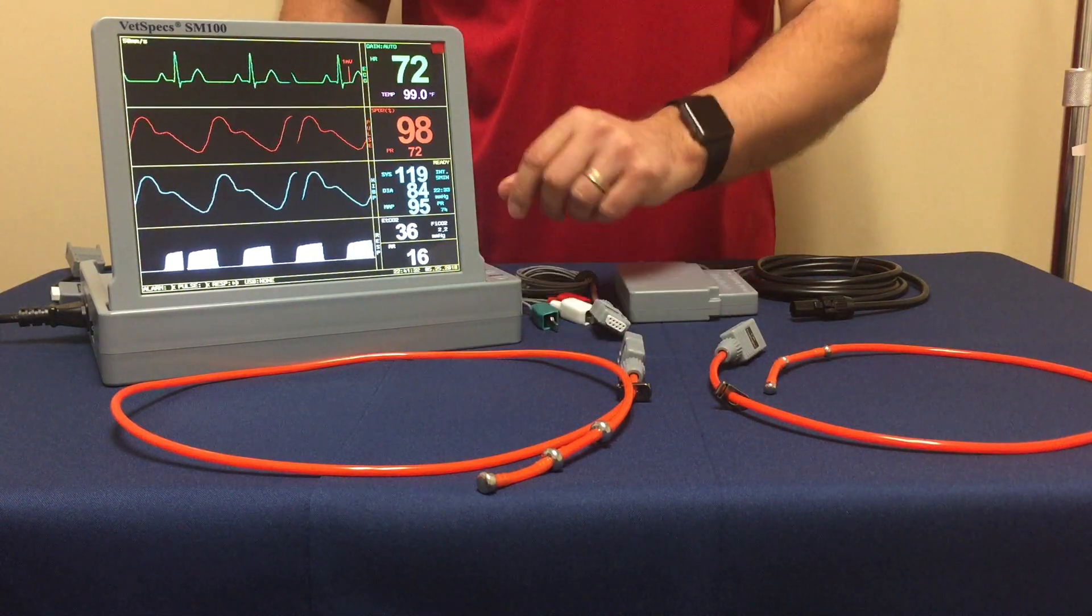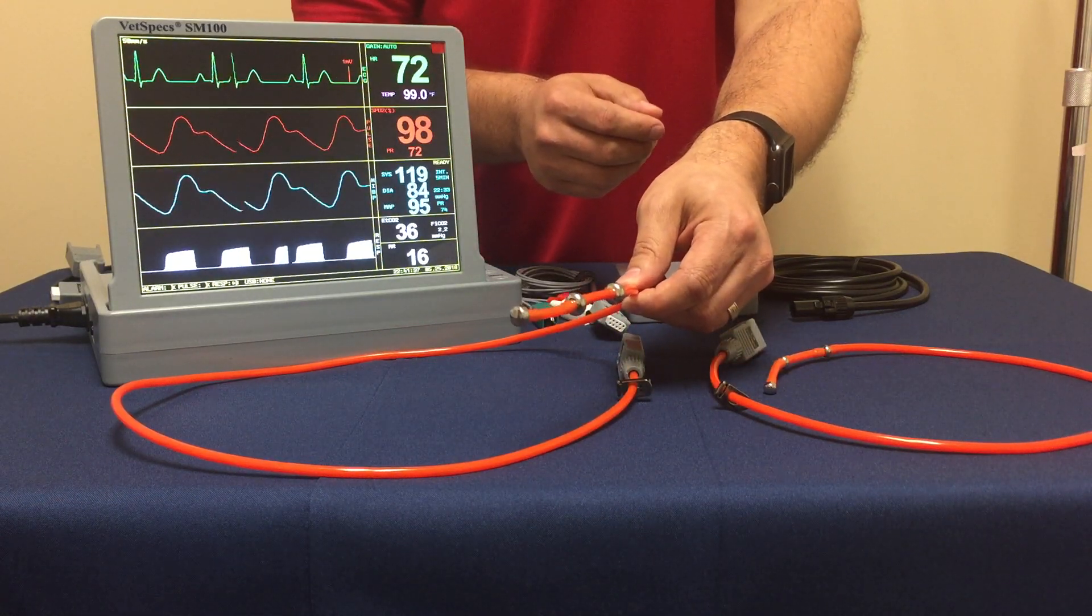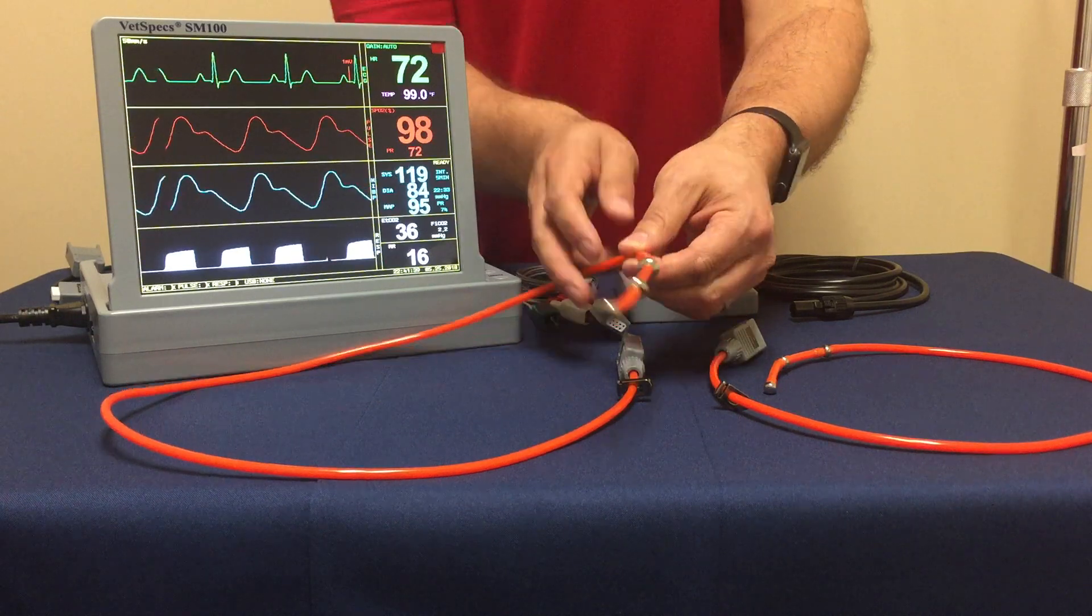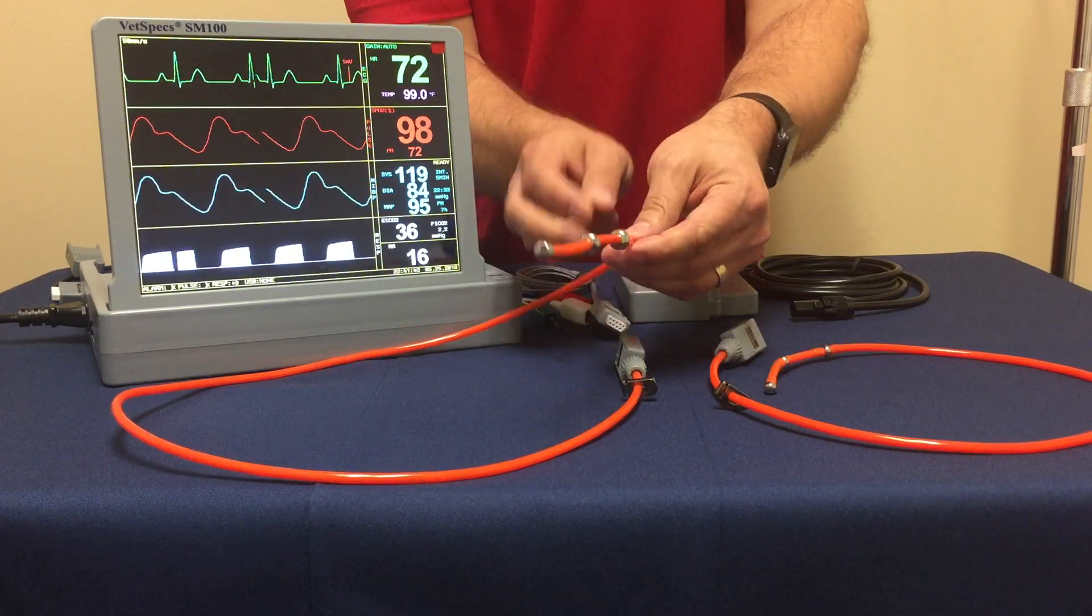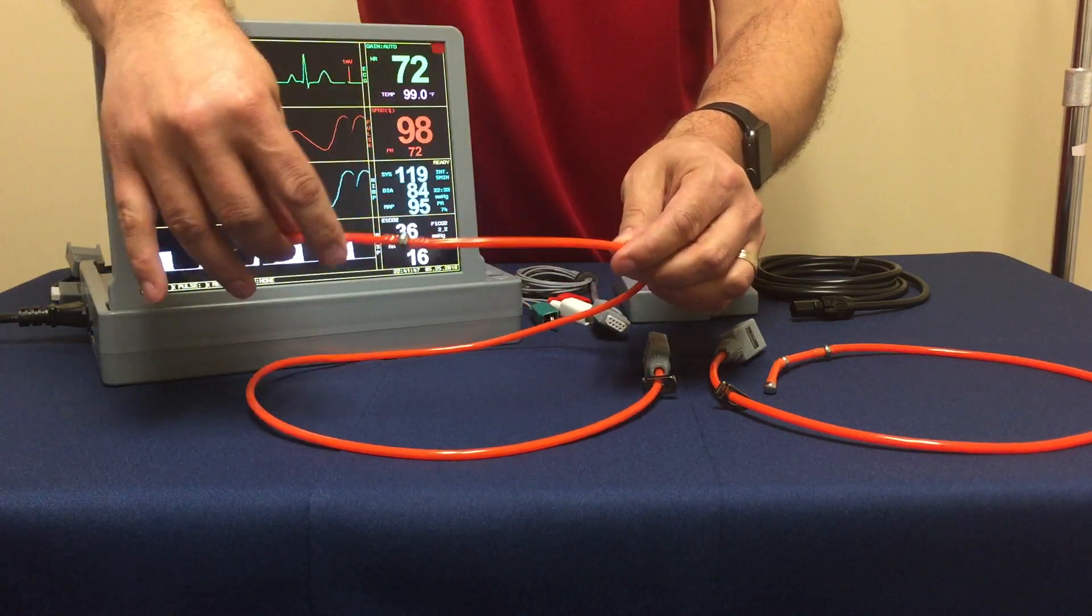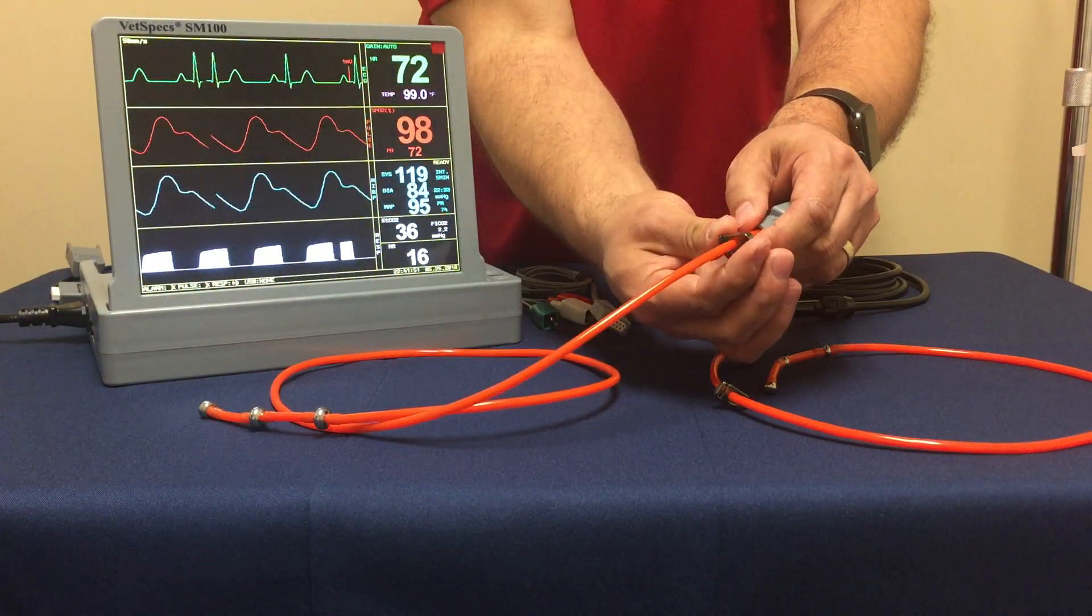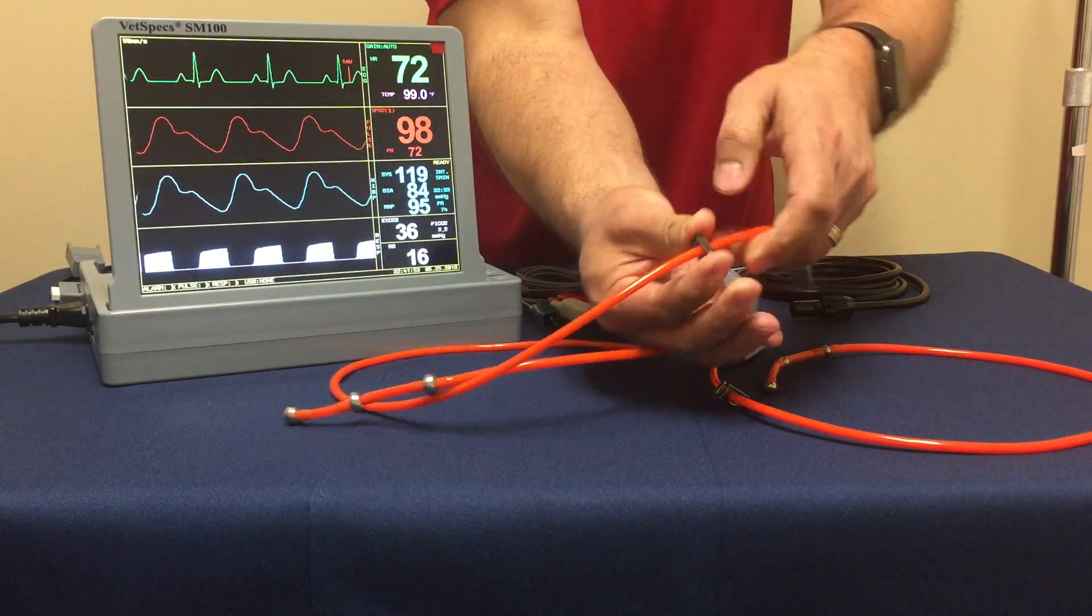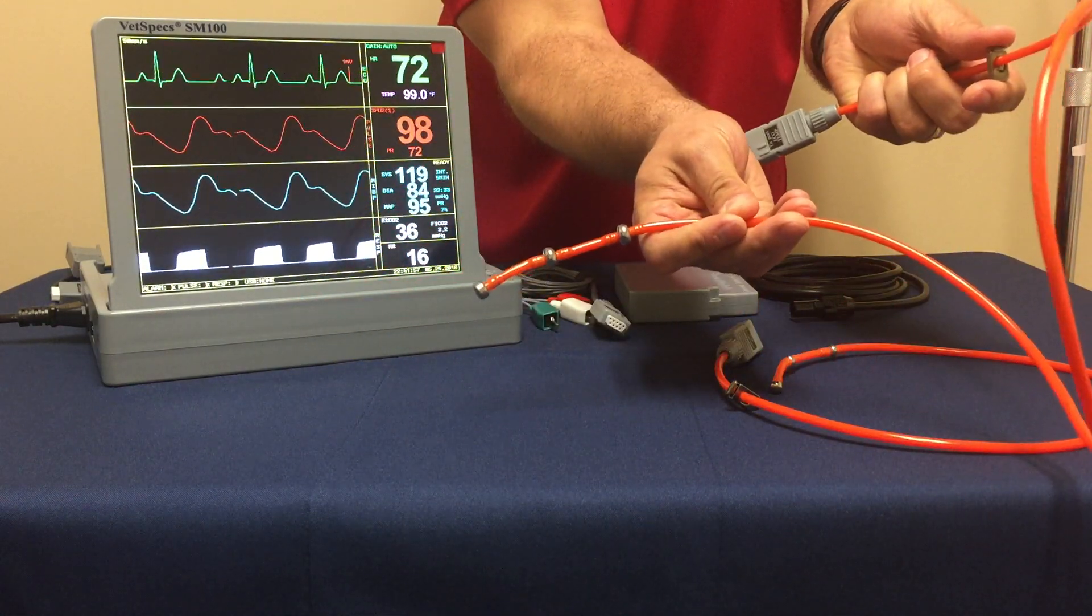For the esophageal probes, it's simply a matter of, for use in intubated patients traditionally for surgical use, just choose your probe based on the patient's size. Insert the probe into the esophagus so that the contacts are in line with the heart. VetSpecs has smartly included a little slide clip so that you can have a pre-measured depth to insert the probe so that you are at the desired depth.